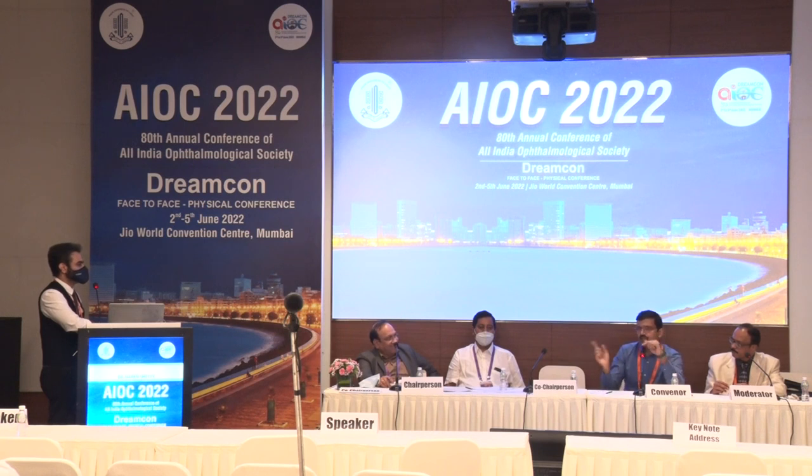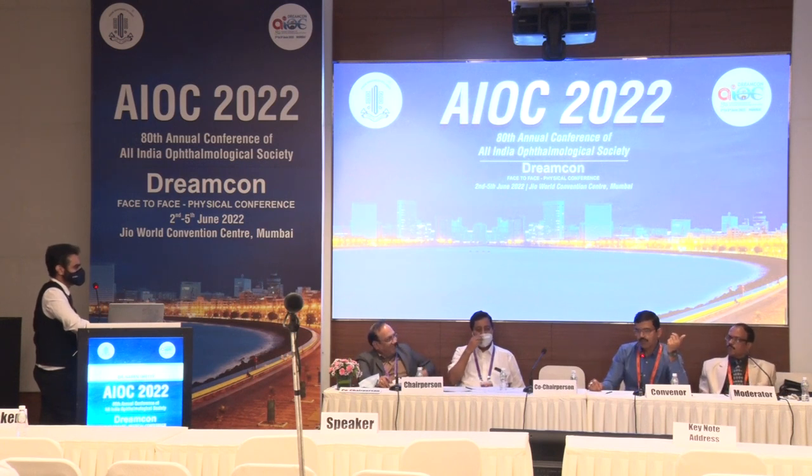The glasses they give you with Ingenuity or Artevo are passive 3D glasses. But yet they pixelate the picture, they layer them. You have around 300 layers for the left eye and 300 layers for the right eye. So at any point in time, you're actually seeing monofocal, and then the superimposition happens in the brain. So I had an issue because I have taken a demo for quite some time, and I did have issues with the strain factor after a long list for the day. So had I been one of your respondents in your questionnaire, I would have definitely not said that I'm very comfortable.